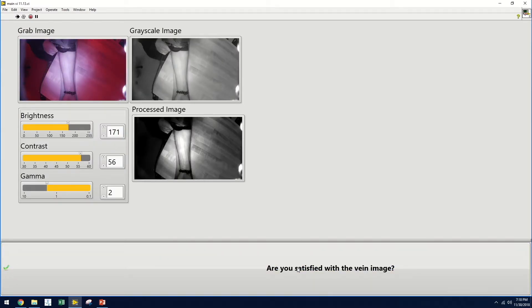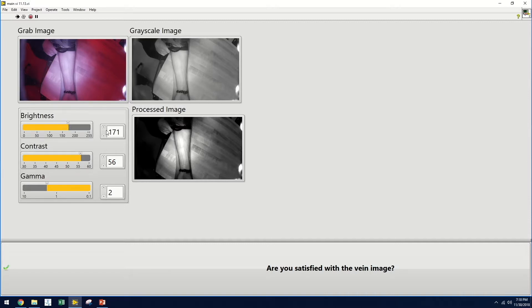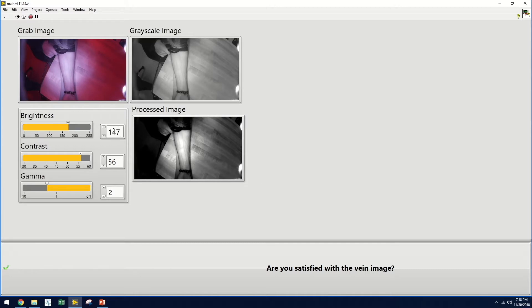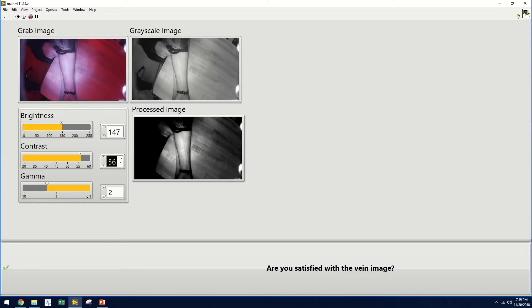Every two seconds, an image is displayed to assist the user in visualizing the patient vein while performing venipuncture. On the top left is the original image. On the top right is the grayscale version. And on the bottom right is a processed image where the user can adjust features such as brightness, contrast, and gamma.